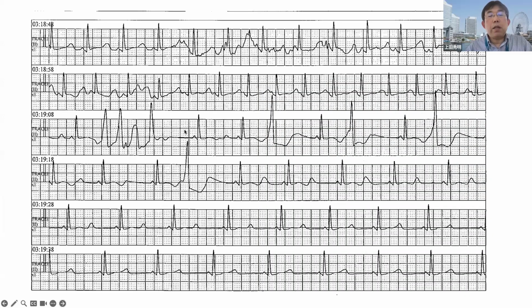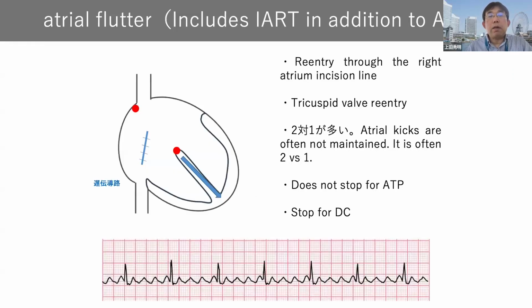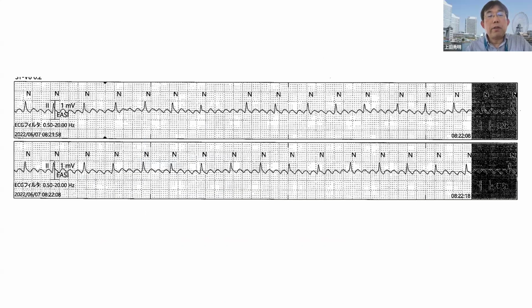And here we can see many PVCs around here. Then unfortunately, the patient has a large R on the T wave, which means that R on T has appeared in this patient, and the patient should be very clinically ill. So we should be very careful and we have to start something. And this is the VT and VF pattern here. And also this is atrial flutter, something like this. It's a very typical one.